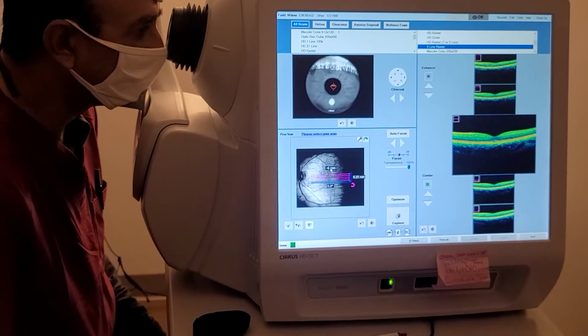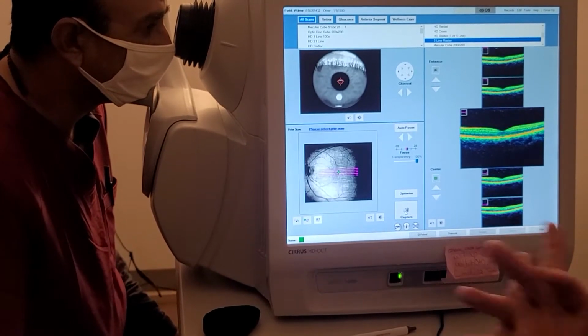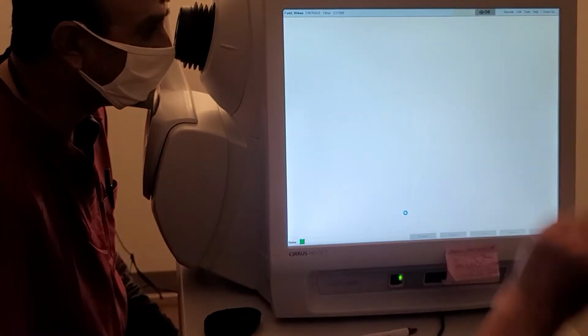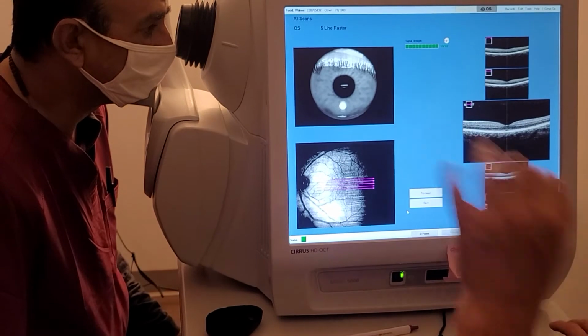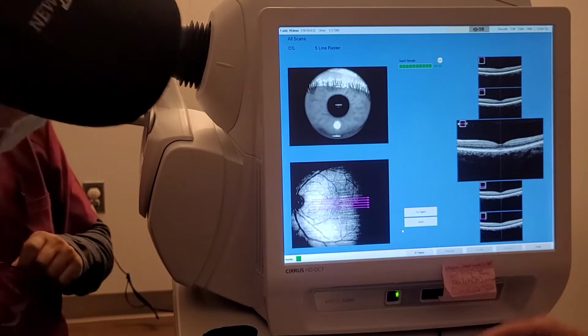Okay, now this is great, right? I don't have to really do anything, so I'm going to go ahead and capture it because I'm clear here. I got a great photo. Go ahead and sit back now, and you can come over and see your results.